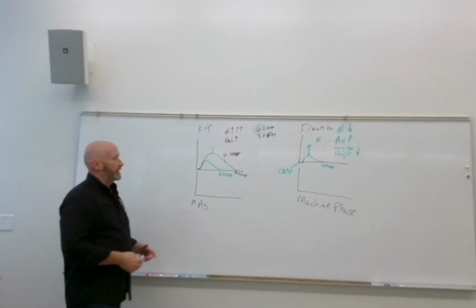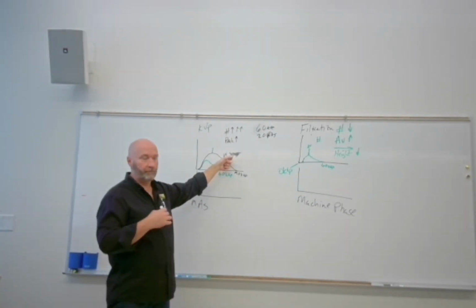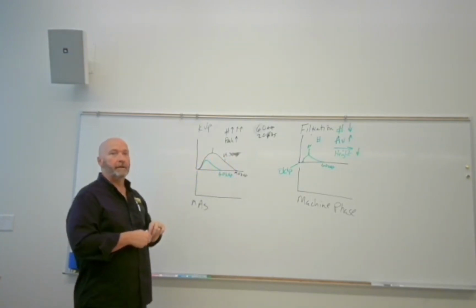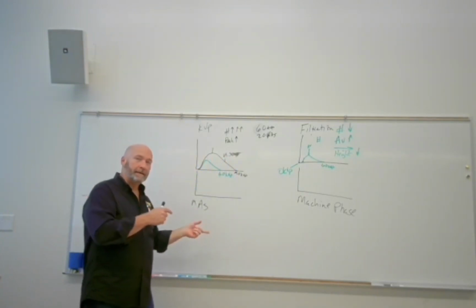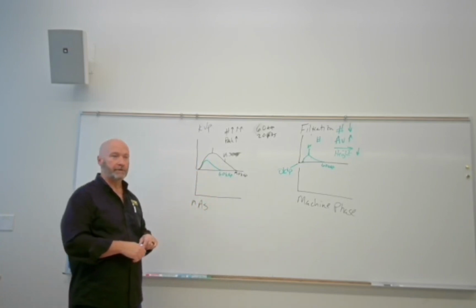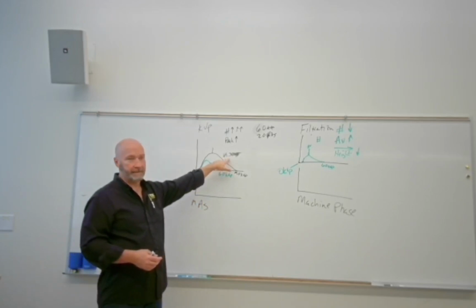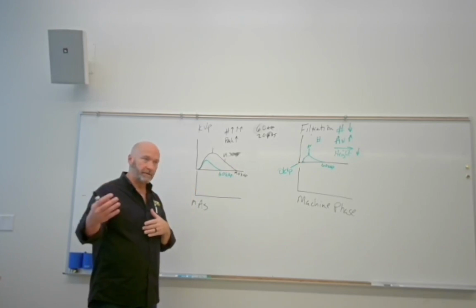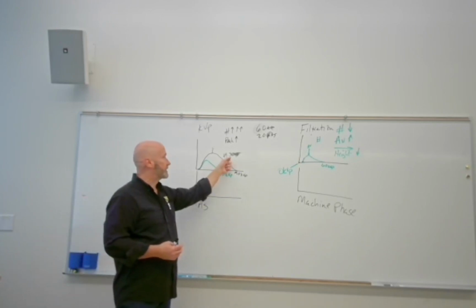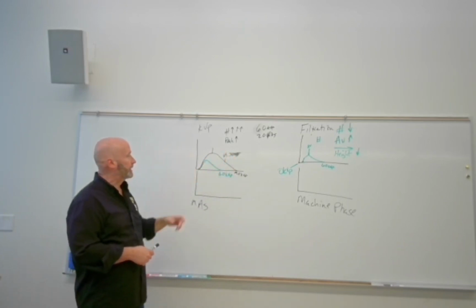So 69 kVp determines whether or not we have a characteristic spectrum. If we're shooting at 68 kVp, we don't have one, right? If you go back around chapter 8, it discusses characteristic spectrum. You know that you create characteristic X-rays, but the only one that we record is 69. The ejection of the inner shell electron and replacement with a free-floating electron gives us 69 kVp, right? So there's only one that we document.